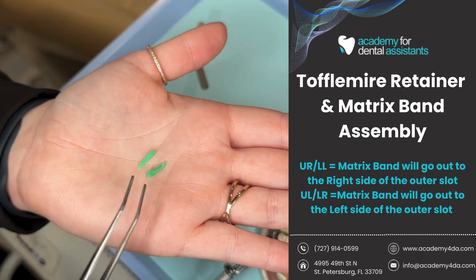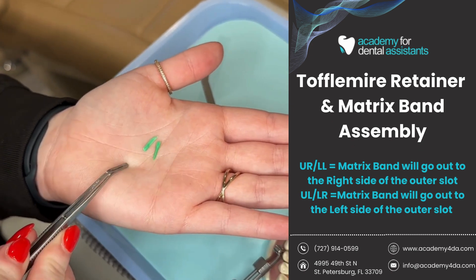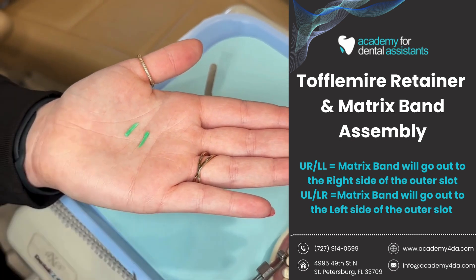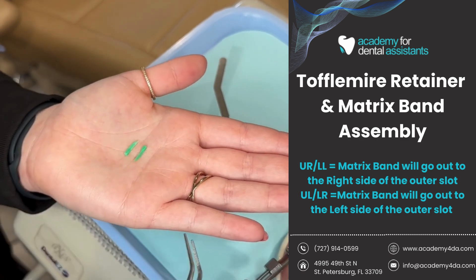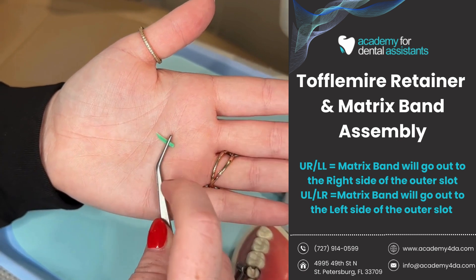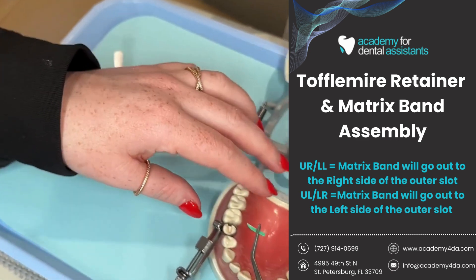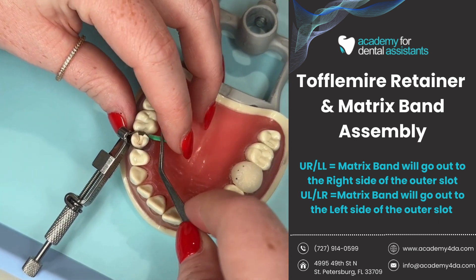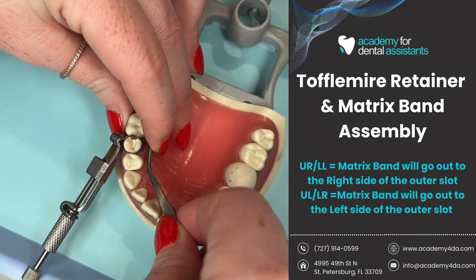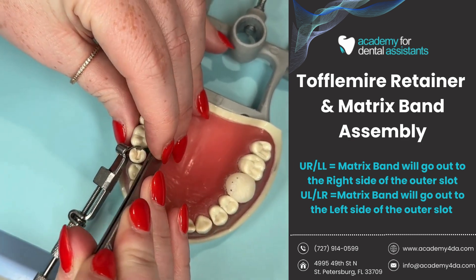These here are my wood wedges — in this case they're plastic, but there are many different kinds. These wood wedges go on whichever wall of the tooth is missing. In this example I have a DO, so one wood wedge will be placed on the distal wall. If I was doing an MOD, both the mesial and distal walls would be missing, so I would need two wedges. Using my cotton pliers, I pinch the flat end of the wood wedge so the pointy side goes through the distal wall. It's always placed from the lingual side on whatever wall of the tooth is missing. I push it as far as I can with my cotton pliers, then flip to the back end to help secure it into position.